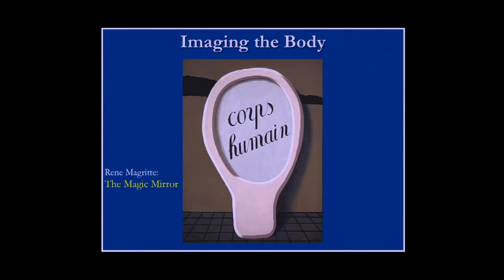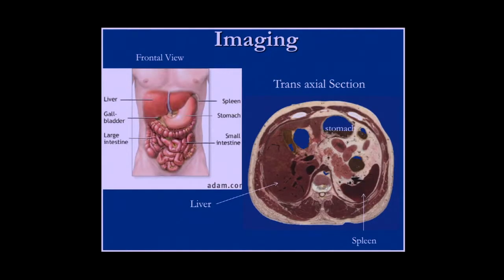So we're imaging the body, and there's a lot of ways to do it, as I just described, including just holding up a mirror in front of yourself. So what are you really doing? My image receptors are having issues, so periodically I may grab my glasses, but most of the time, what we're seeing is a representation, not the reality. So I'm going to describe a way of representing the body, so you see each of the modalities from the same perspective, and give you some orientation and some terminology.